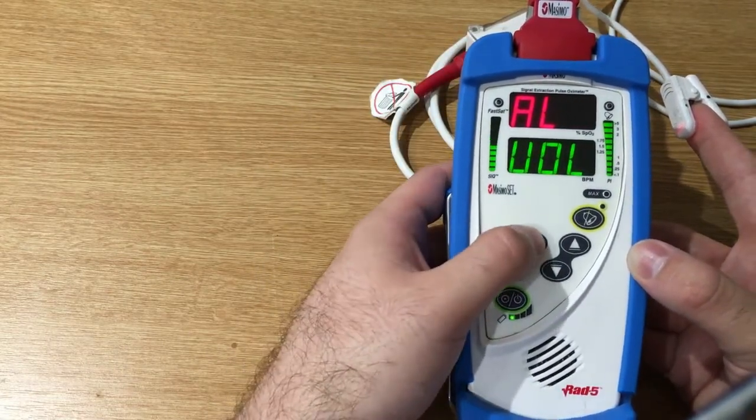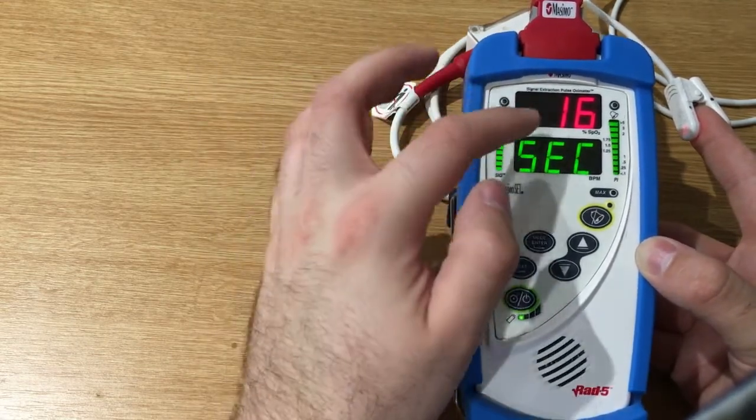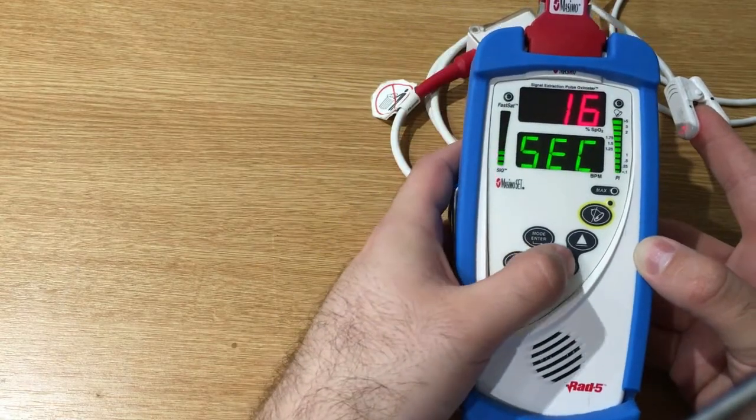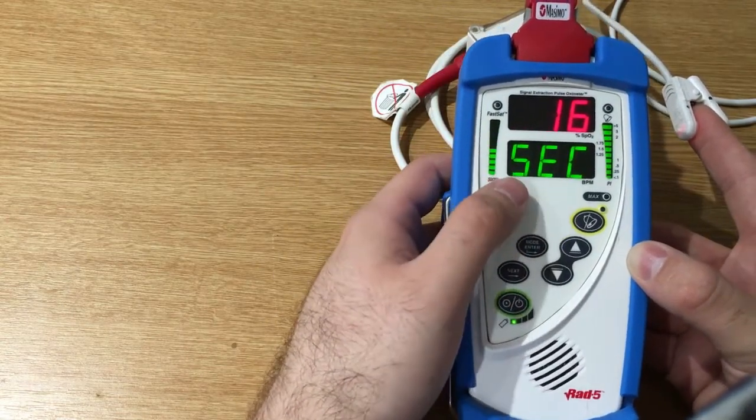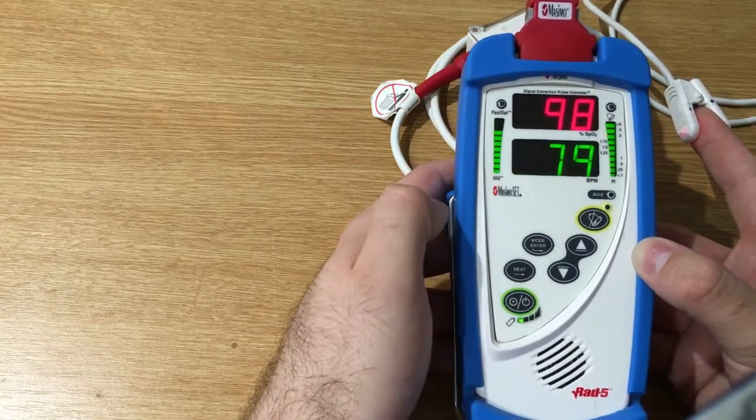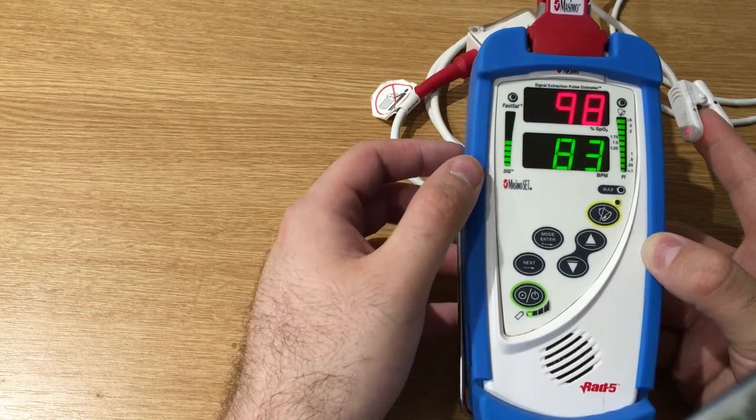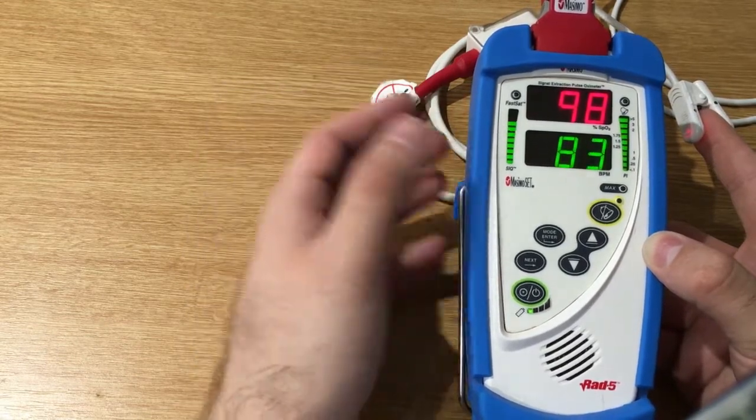Pressing this button we move into another menu, and here we can select the averaging time. This can go down to two seconds and allows for high fidelity pulse oximeter performance.